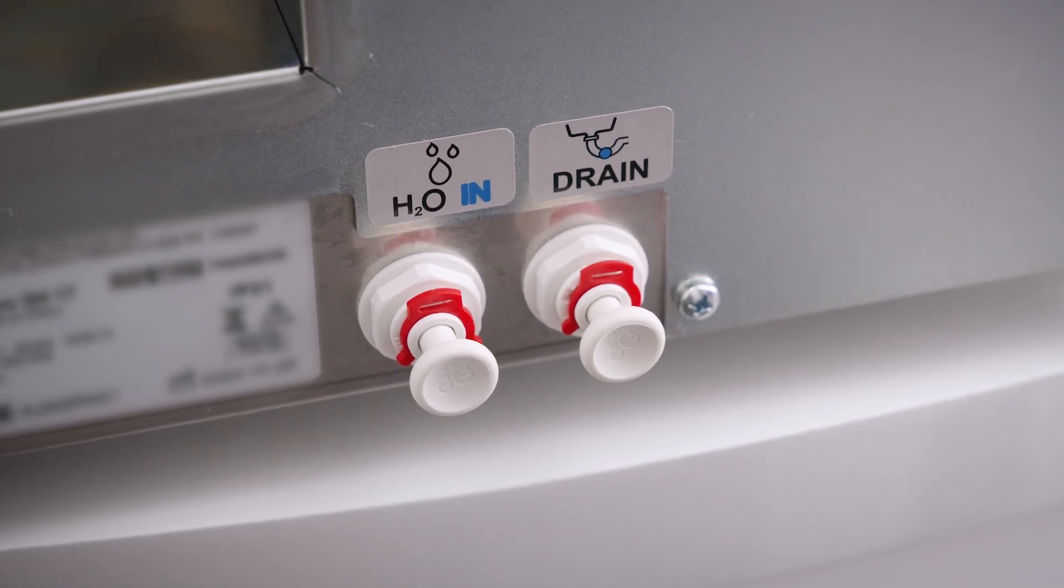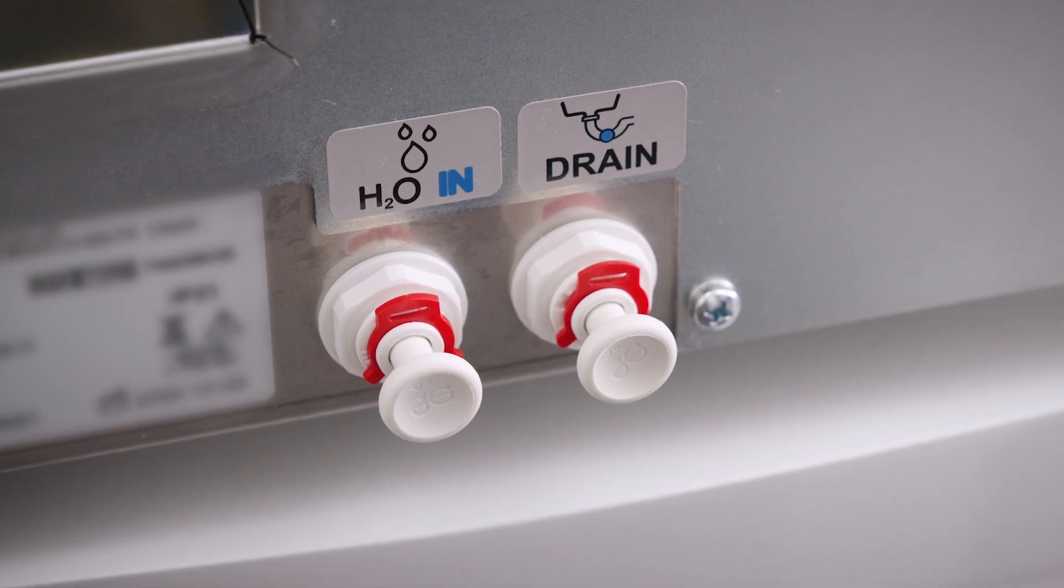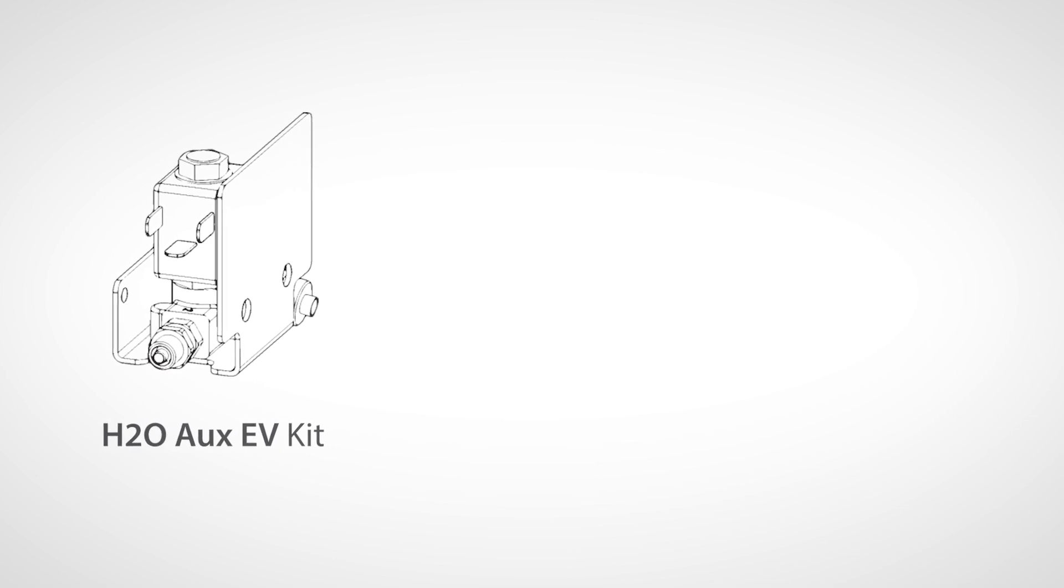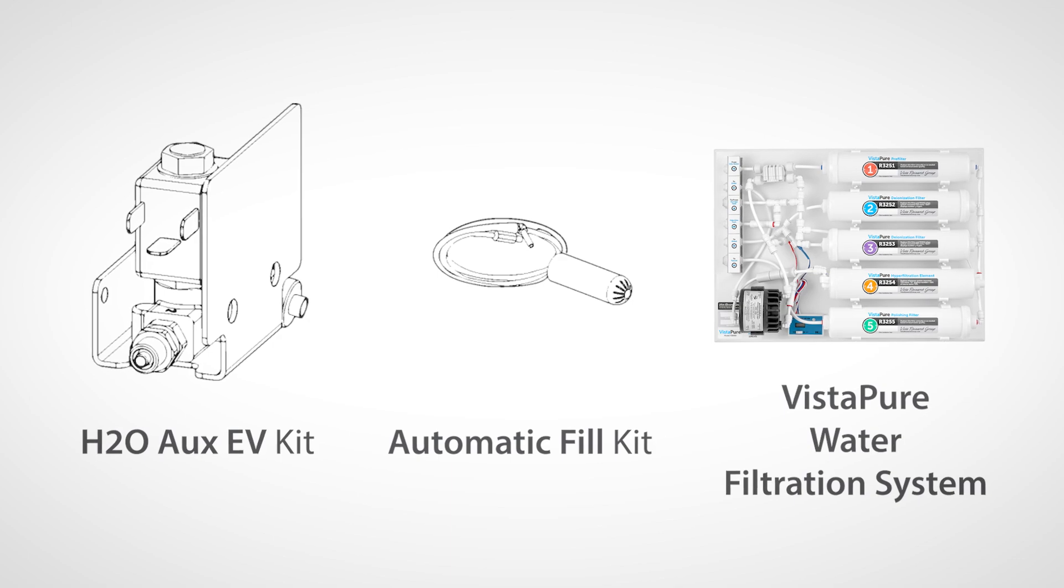The preferred method for filling is to use the automatic filling option, which ensures your sterilizer has a constant supply of demineralized water. This can be done using one of the several options available, such as the H2O auxiliary EV kit, the automatic fill kit, and the Vistapure water filtration system.